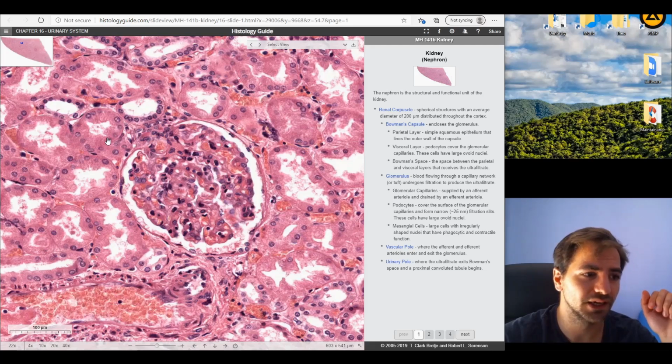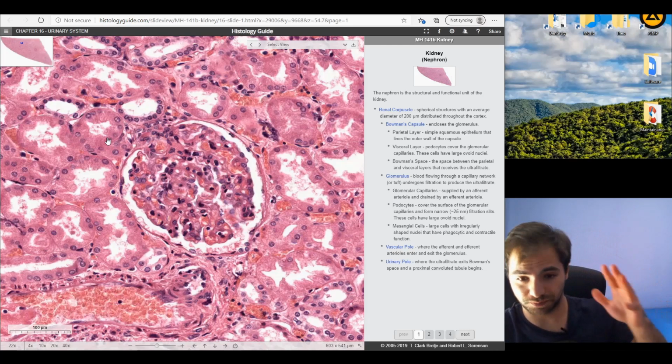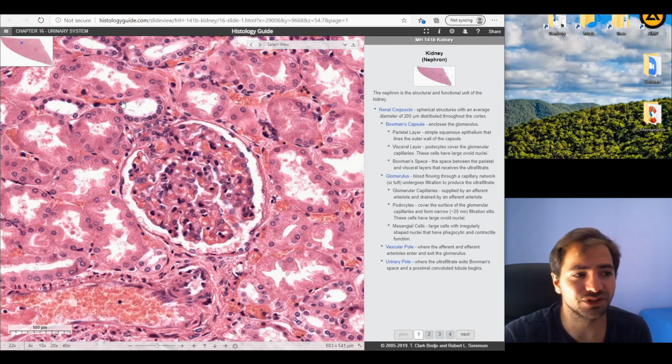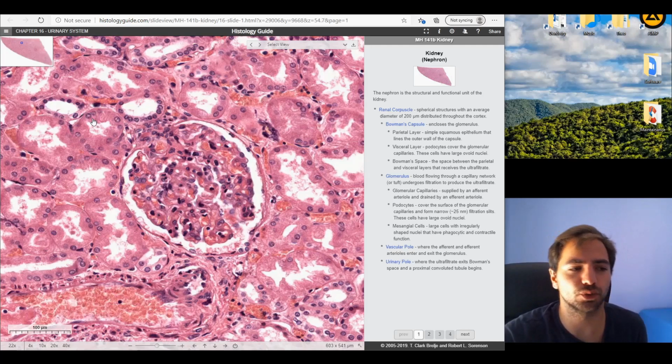This is the second one. The DCT, the distal convoluted tubule, is always close to the macula densa. In fact, we should be able to find it close to the vascular pole. So this is the vascular pole again, and this is the ideal example of the distal convoluted tubule. Now it's very easy to see the differences in the appearance of the nuclei, and of course the height of the cells themselves. We can see that the PCT has taller cells, more columnar-like, short columnar to high cuboidal, and the typical DCT contains short cuboidal cells. So this is the first part we should discuss and understand.